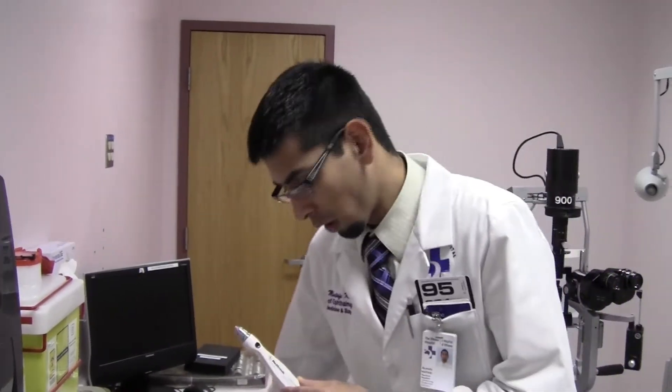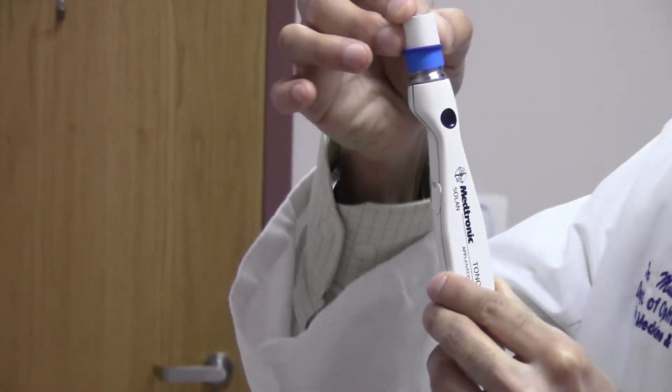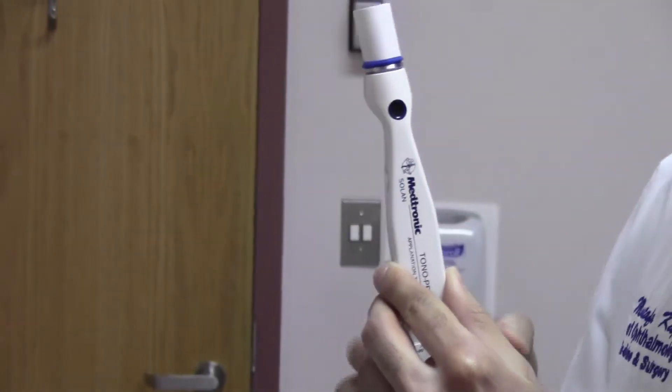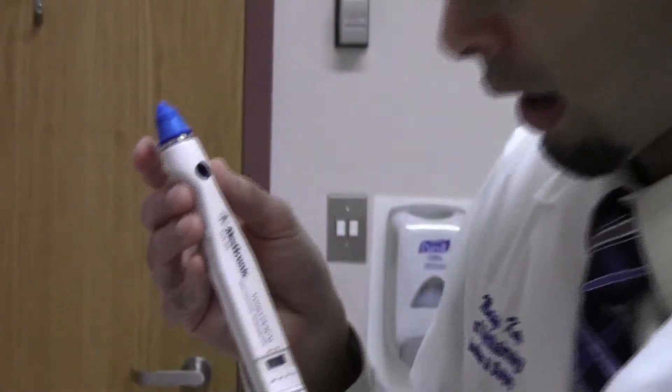Let's start by putting in one of the condoms. The condom will come just like this right out of the package. It's placed on top of the tonopen just like that, and then the sleeve is brought down. The tonopen is now ready to use. You just need to remove the cardboard tip just like this and we're good to go.